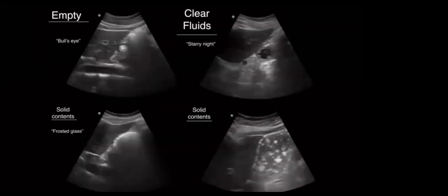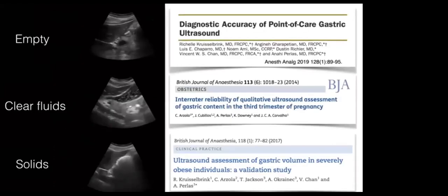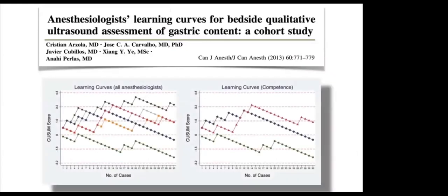How good is this pattern recognition? Well, we have done studies in adults, pregnant patients, and also obese patients, and it's very reliable. When we do the qualitative assessment, it takes around 30 cases to learn to do this technique.